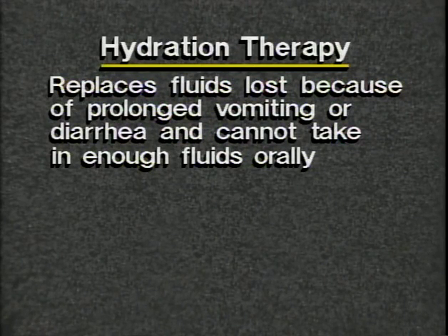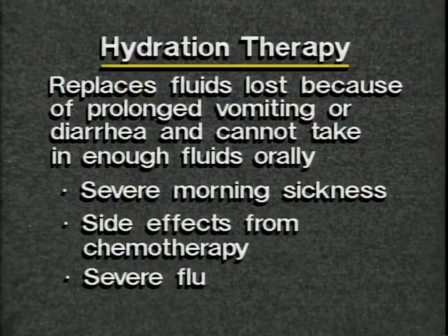and cannot take in enough fluids orally. Patients experiencing severe morning sickness, side effects from chemotherapy, or severe flu may receive home hydration therapy for short periods.